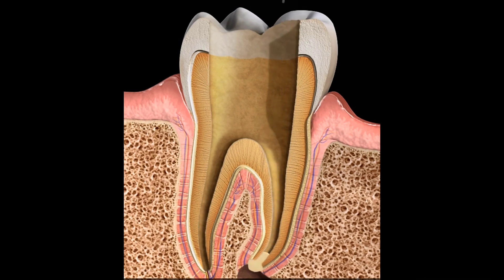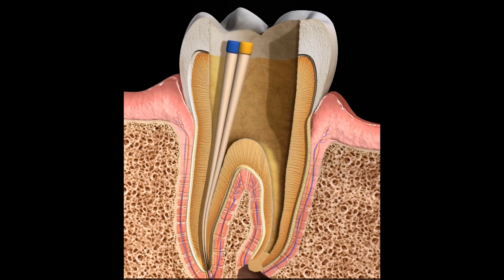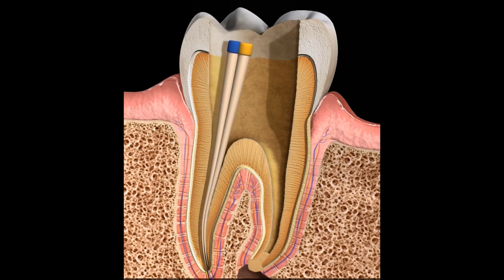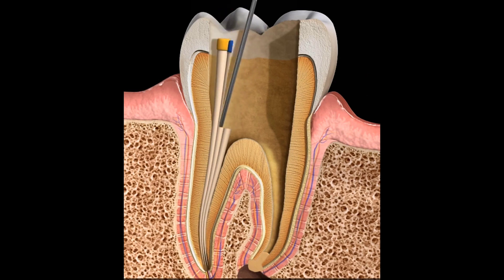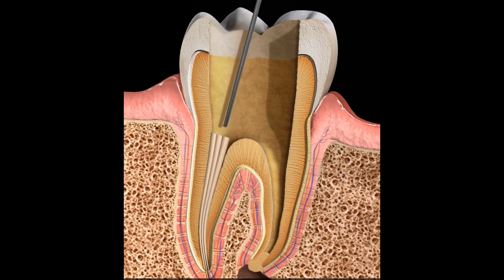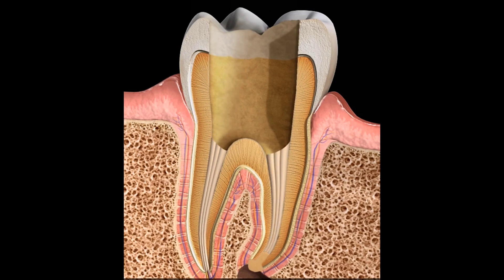A material called gutta percha is then used to fill and tightly seal the root canal system. This material is bioinert, so it does not react with the body. It is inserted, impacted, and cut to the desired shape.